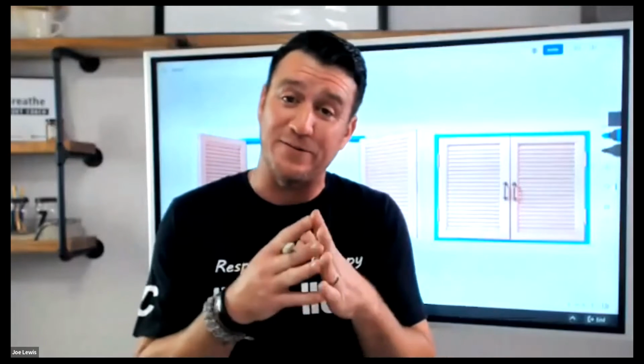See, I got a comment here that says PEEP it up. That's exactly right. PEEP it up. We've got to use PEEP, but we have to find it early.